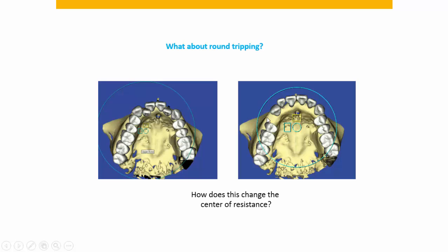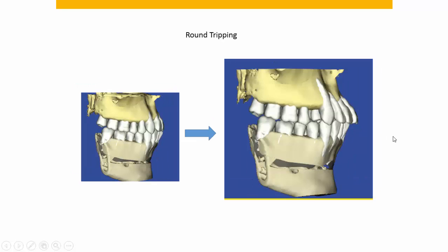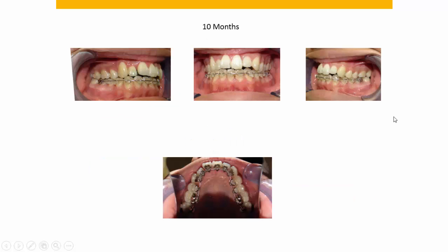I simulated what it would look like to round trip the teeth as opposed to retracting the cuspid and bypassing the lateral and central incisors. From the axial view the teeth are lined up enough so the wire can fit in the slot, but from the coronal or sagittal view the teeth are blown through the cortical plate. We may not fully understand the long-term clinical significance of round tripping at this time, but if you can avoid it, why not?